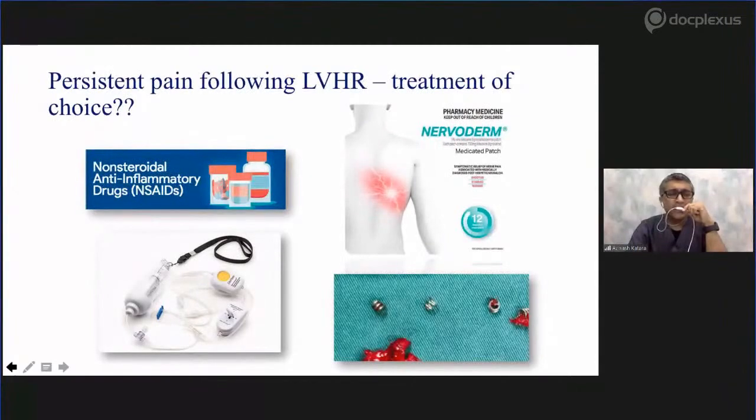Now, if I may add one more thing, Shiva, sorry. It is important to reduce the pressure of the pneumoperitoneum before actually measuring your size, because a tense abdomen may give you a wrong reading.